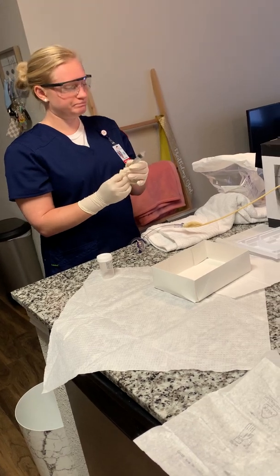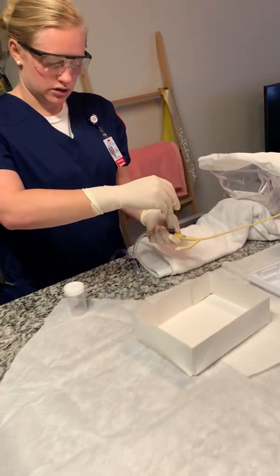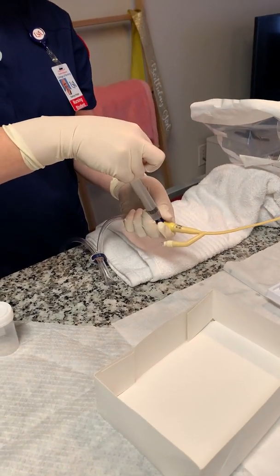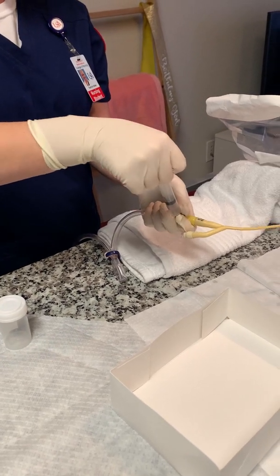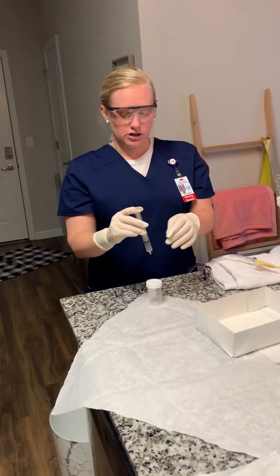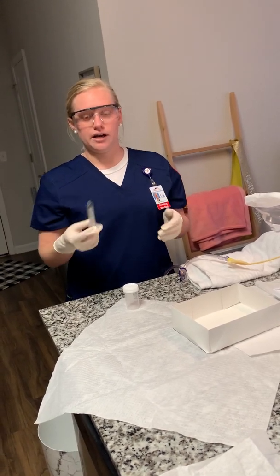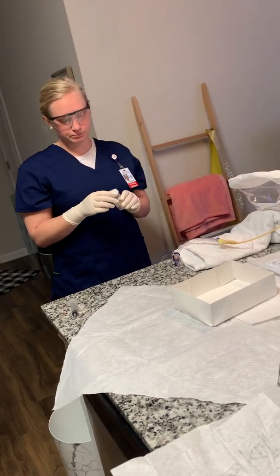Some water, and then I put it in this port right here, and just take as much as you need out, and then I would put it in the container with the cap off, obviously, and just not touch any of the sides. I'm going to keep this for later because I'm going to need it. So then I would label it and send it to the lab.